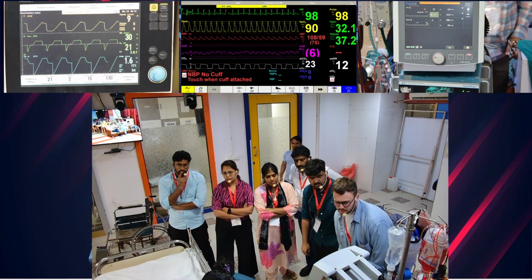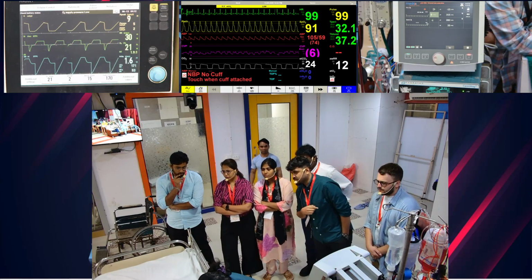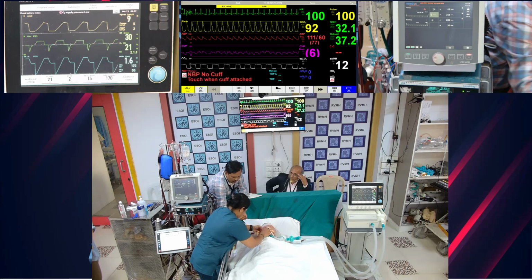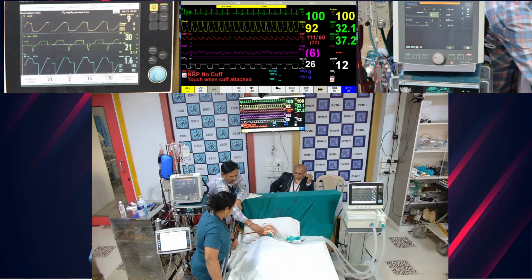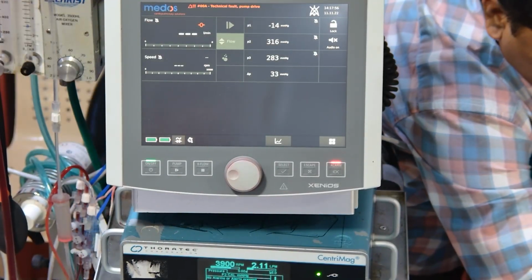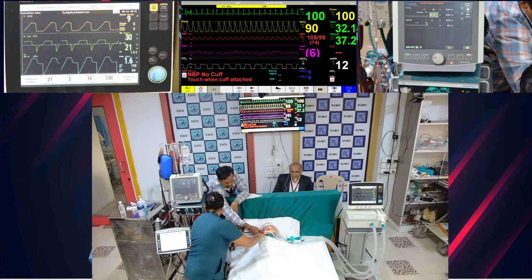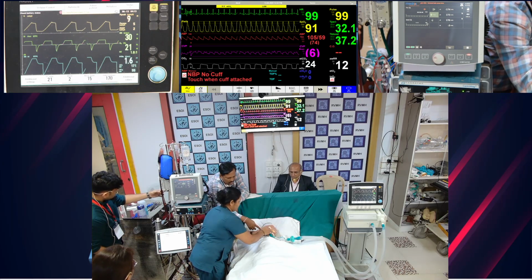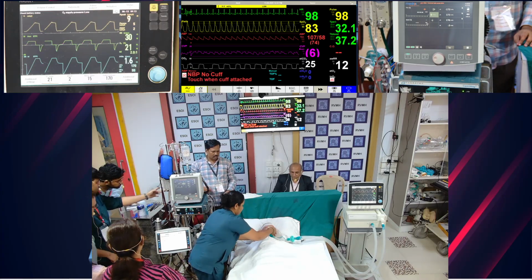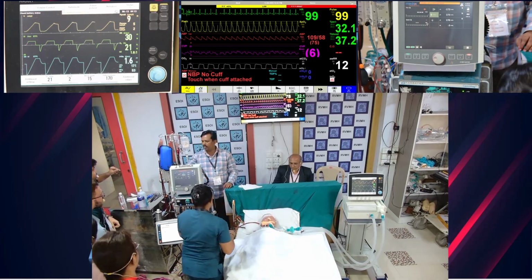If you want to ask me anything, you can ask me. Ventilator settings: 21% FiO2 is on the ventilator only. On ECMO, the sweep gas and blender: how much is the gas flow? FiO2 is 100. Sweep gas is 3 liters.